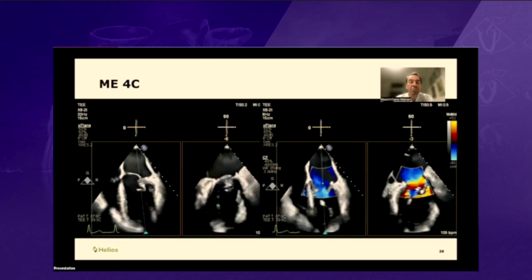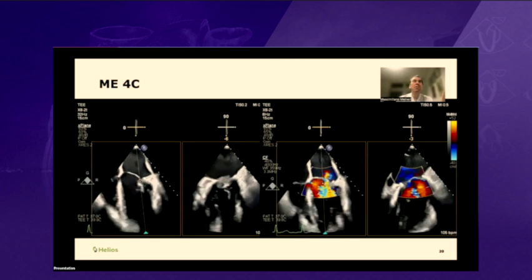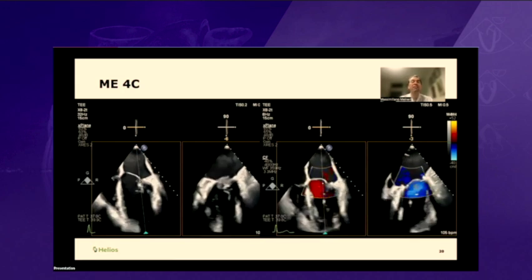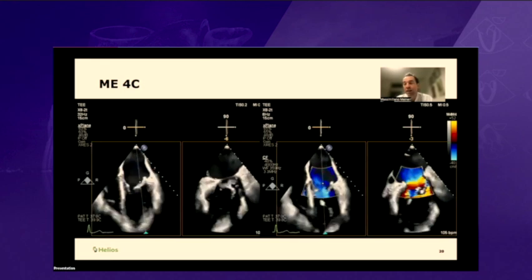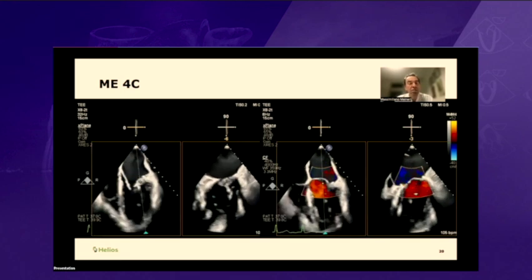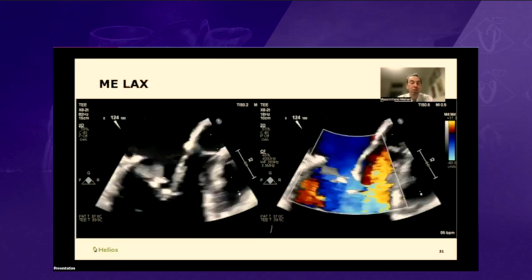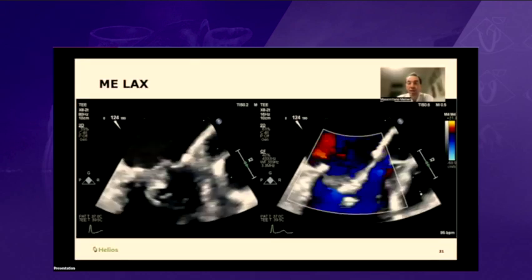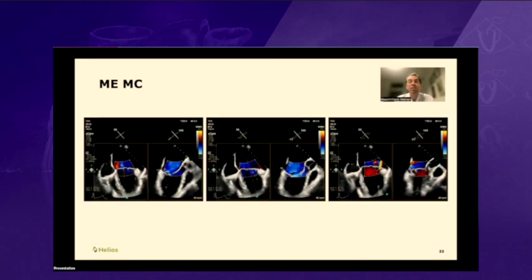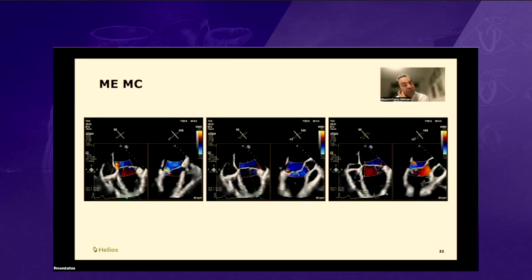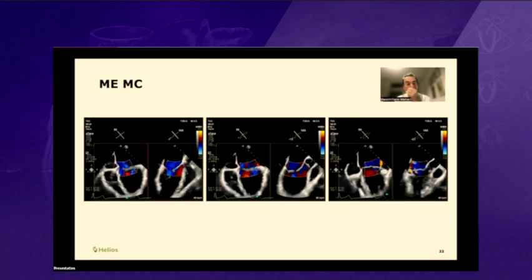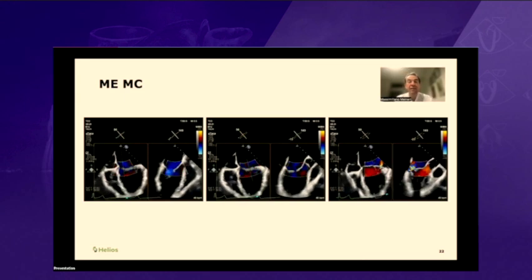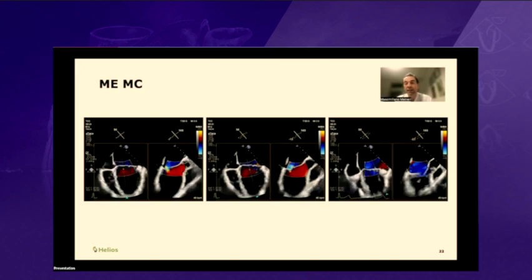We came off pump and did what we call a trial — we haven't reperfused yet. We still need time to warm up the patient, but we come off pump quickly and look at the valve. In four-chamber and two-chamber views, we look at flow, color, and morphology. The valve shows no more prolapse and no flow. In the long axis view, we identify a very small regurgitation jet. With X-plane, I start from the center of the valve in the mitral commissural view and go right and left — I can identify a small jet medially and a small jet laterally.